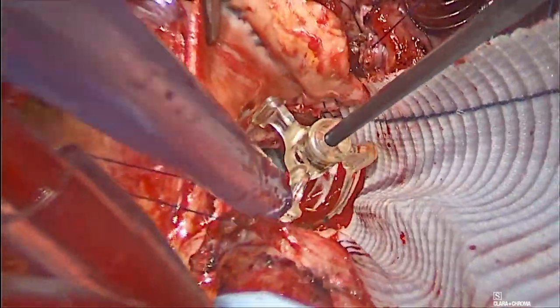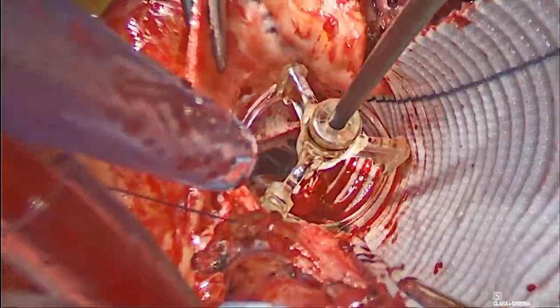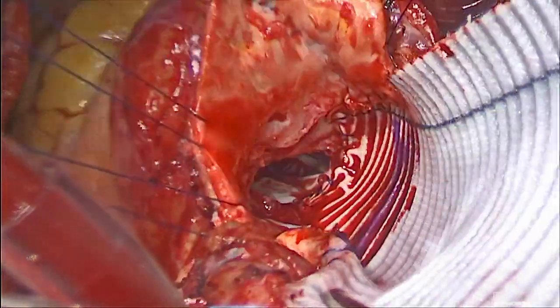When this was completed, valve sizing was done again. As illustrated, we were able to fit the size 25 valve very easily.